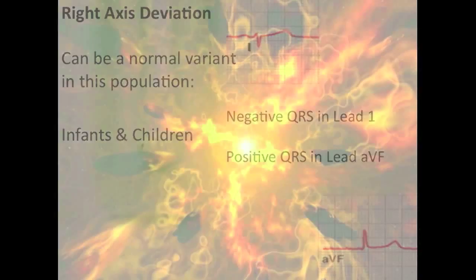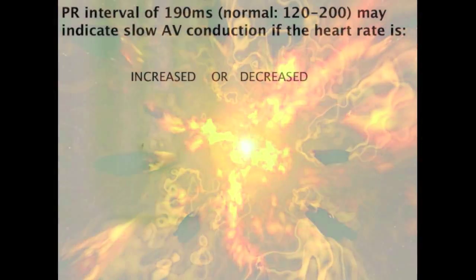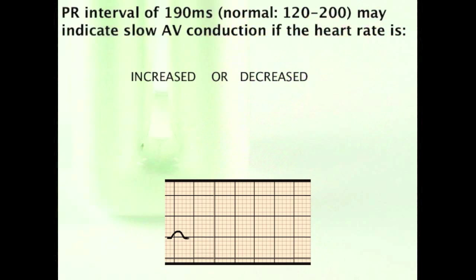Although within the normal range, a PR interval of 190 milliseconds may indicate slow AV conduction if the heart rate is increased or decreased.